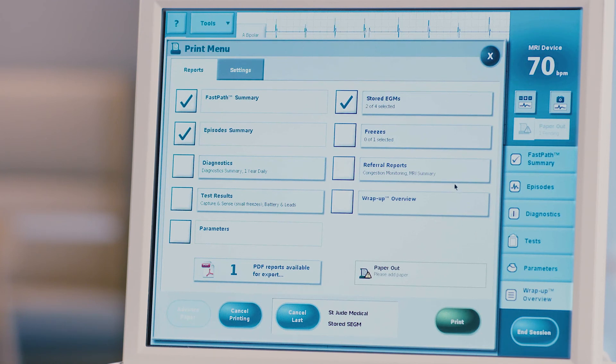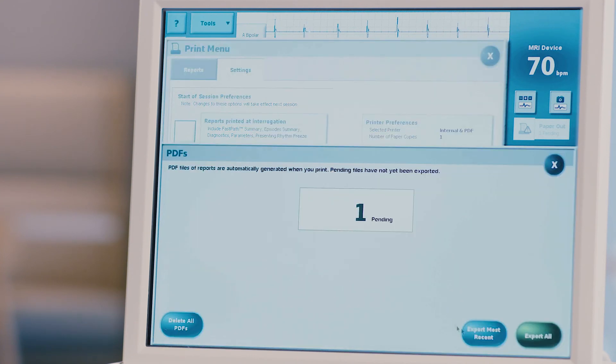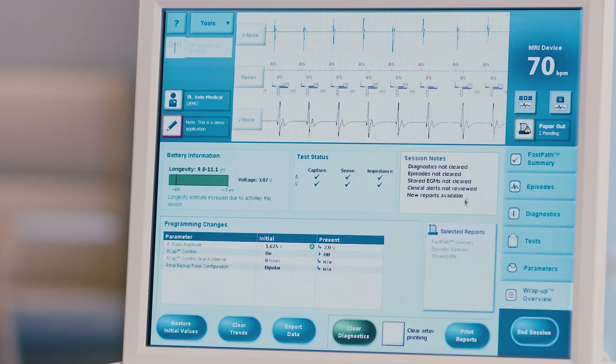You can change the printing output, internal printer, external printer, or PDF report, in the settings tab at the top of the screen. If you need to save a PDF of the reports, click PDF reports available and choose export most recent. Press X to return to the wrap-up overview screen.